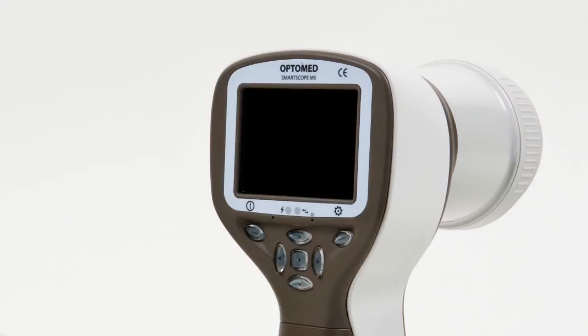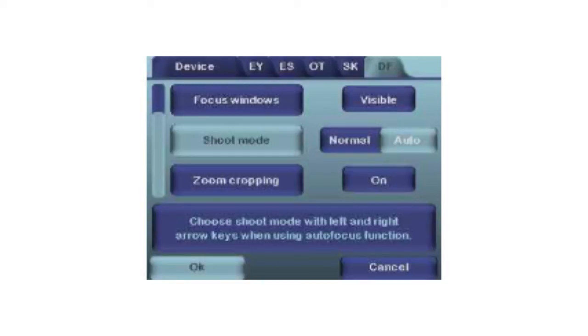Shoot mode. When autofocus is activated, there are two shoot modes that can be selected from the menu: Auto and Normal. The shutter button operates slightly differently depending on the selected shoot mode. More information on shoot mode can be found in the user's manual.